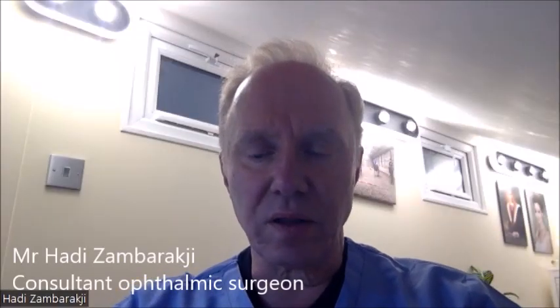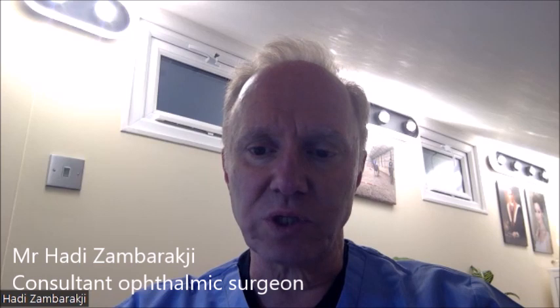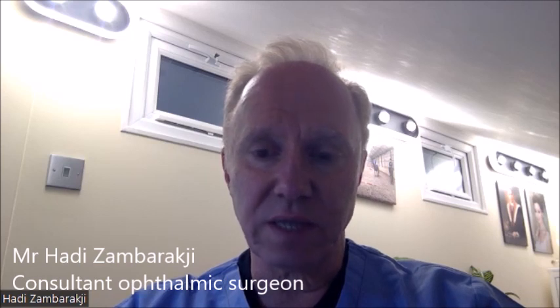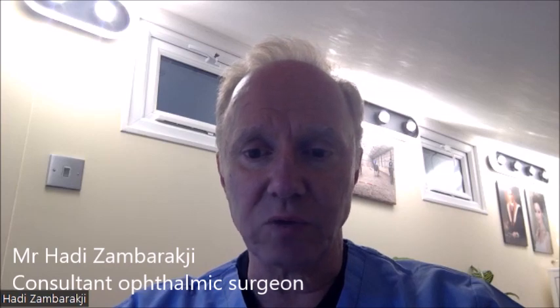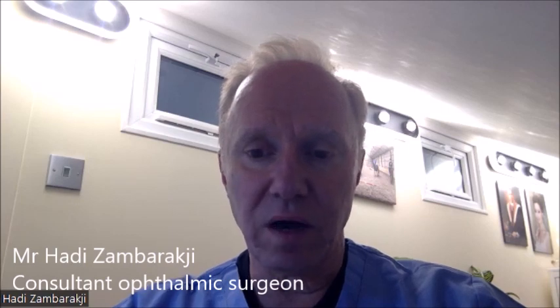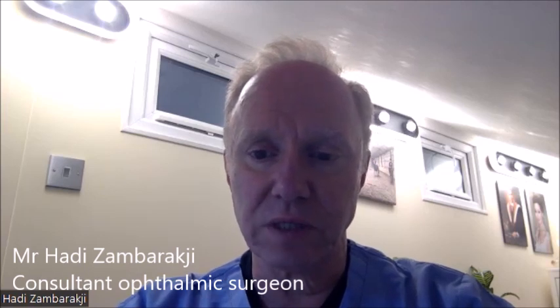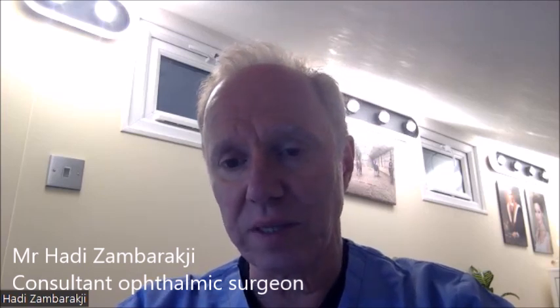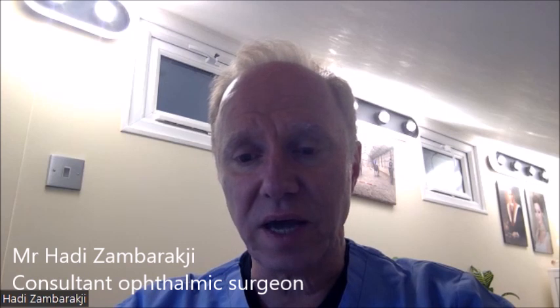So there are several different types of lens implants on the market, but broadly speaking, you have monofocal lens implants, which are, as the name implies, lenses that have a fixed focus. And by this, I mean when you insert them into the eye, you can either aim to give the patient distance vision or near vision. And then you have multifocal lens implants, which are designed to give the patient vision at multiple focal distances. So that means these lenses are designed to improve both distance and near vision.